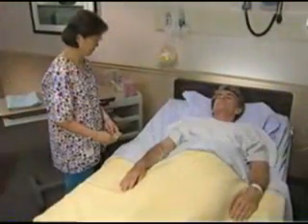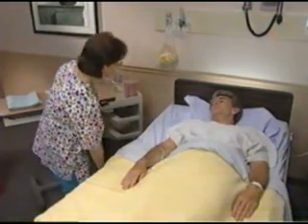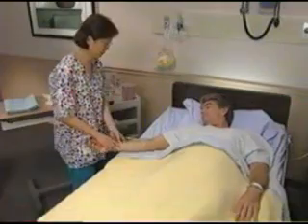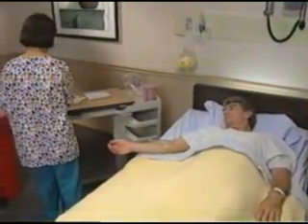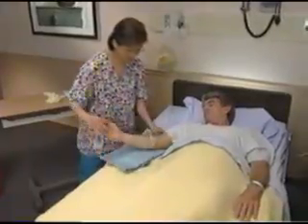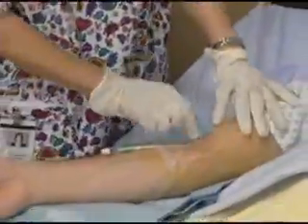Before removing a central venous catheter, especially a PICC line, it's important that you know the length of the catheter. After washing your hands, explain the procedure to the patient. Help the patient to a supine position, making sure the head of the bed is flat and his arm is at a 45 to 90 degree angle to his body. Place a linen saver pad under the patient's arm. Put on clean gloves. Carefully remove the old dressing.